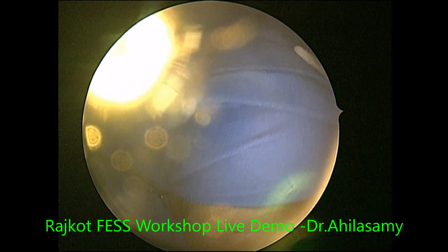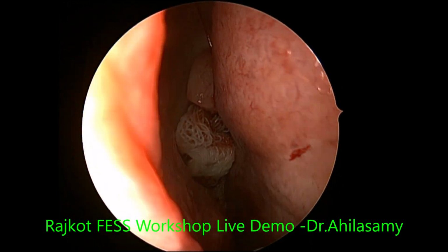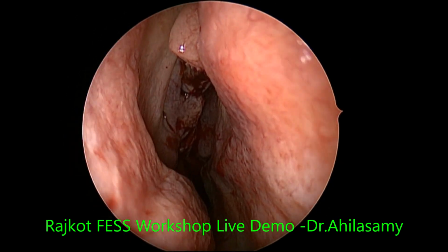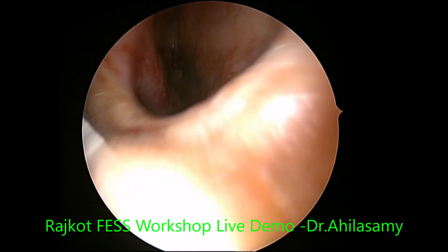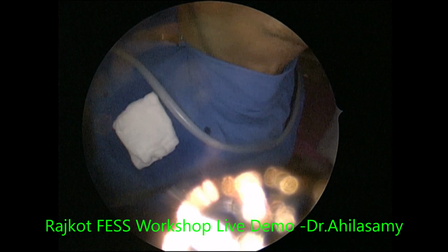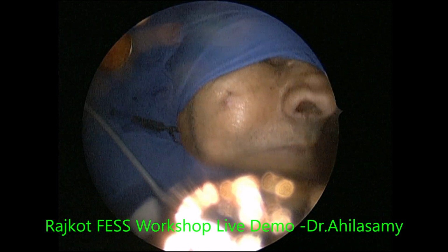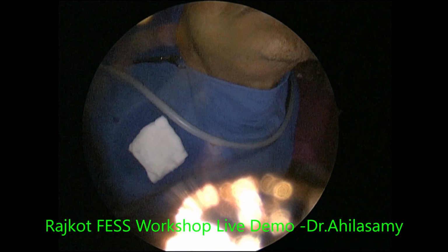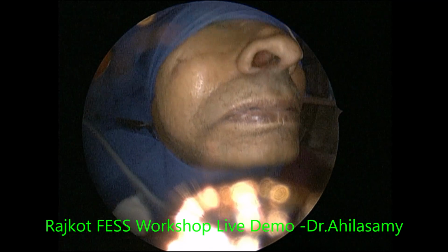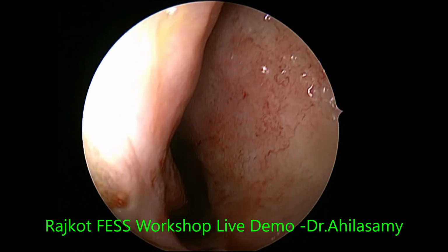So give 1 minute or so for the local pack to act to stop the bleeding from the infiltrated needle puncture area. We have got a good decongestion, and the patient is also very cooperative. Remember, it's a 74-year-old man, and you should not cause any pain that may aggravate his cardiac status. There should not be any pain shock, and do surgery very gently, meticulously, with care.